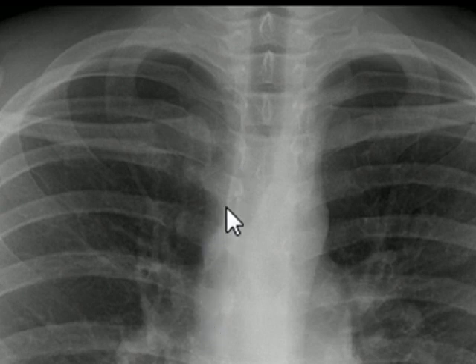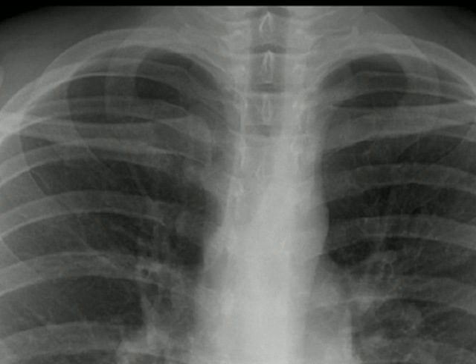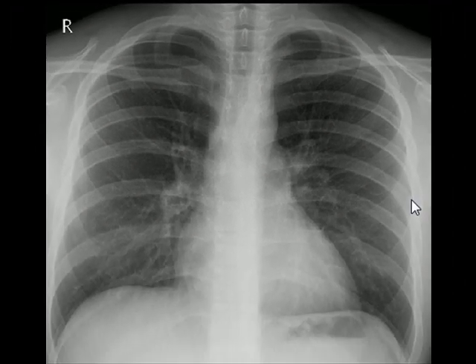This is the tracheobronchial angle just above the azygous vein. The azygous vein is a normal structure here, but will be moderately enlarged in the presence of hypervolemia, systemic venous hypertension, right heart failure, and inferior vena cava obstruction. The normal size of the azygous vein is less than 7 mm on an erect PA view. On X-rays taken in the supine position, the azygous vein may artificially appear enlarged.